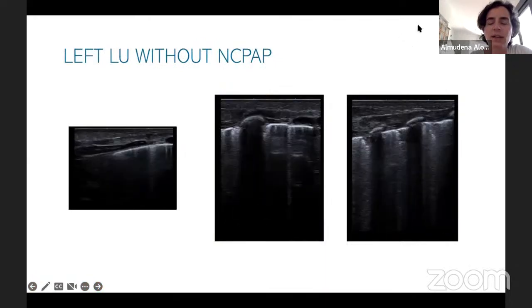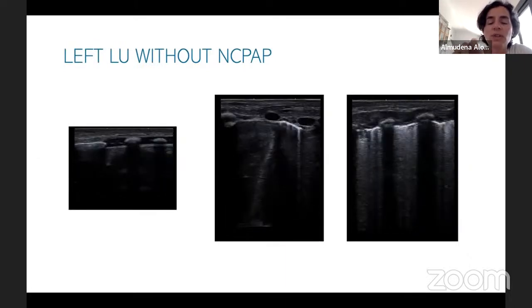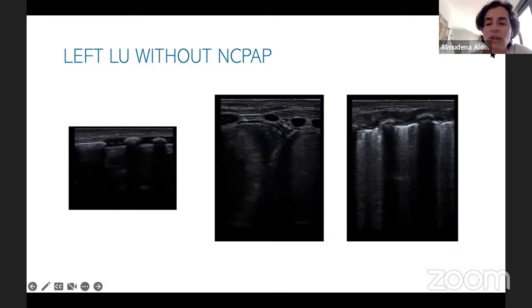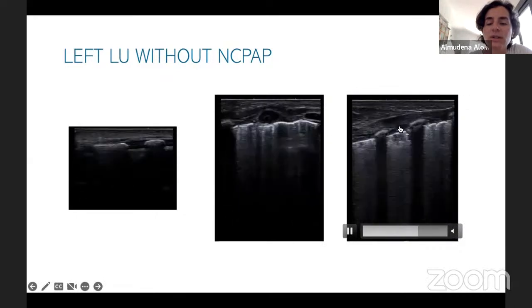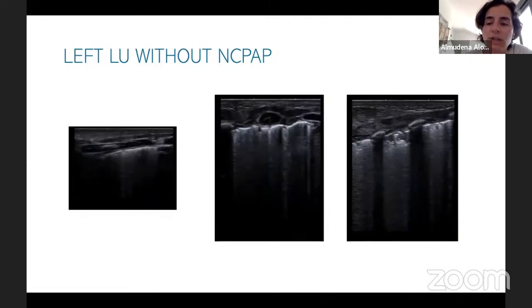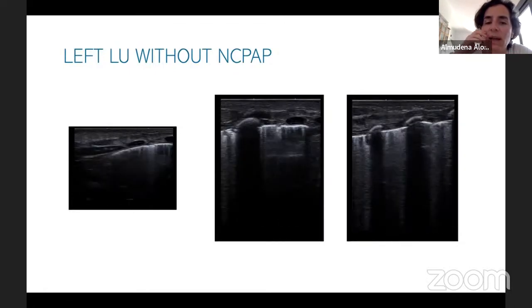The idea is that when you use lung ultrasound, you can see the de-recruitment of the lung. Okay, here you can see an example of this, in which the lung was aerated, the baby needs oxygen again, and you see the appearance of consolidations in almost all areas evaluated. Then you can think that this infant is getting de-recruited and needs non-invasive ventilation again. That would be the idea.